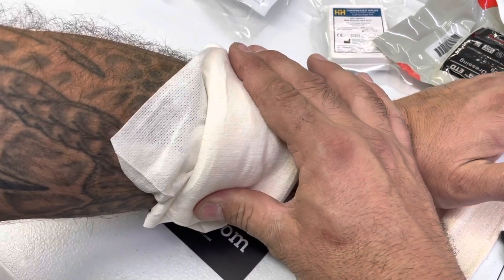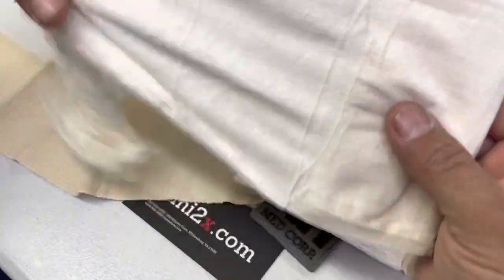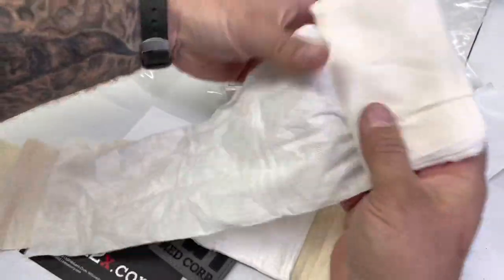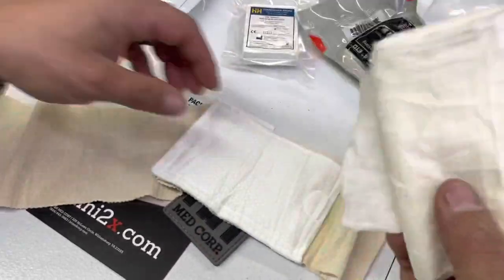Then you use your compression bandage to apply pressure, because wound packing reduces clotting time from about 10 minutes with just direct pressure down to about three minutes when you pack and apply pressure. Using a pressure bandage like this frees up your hands so you can work on something or someone else.